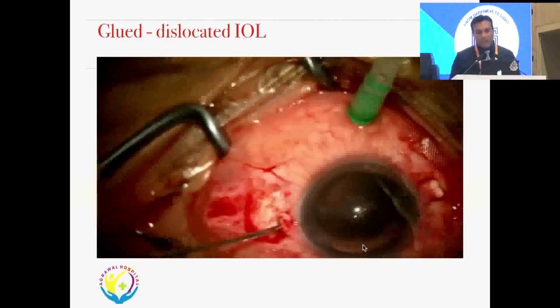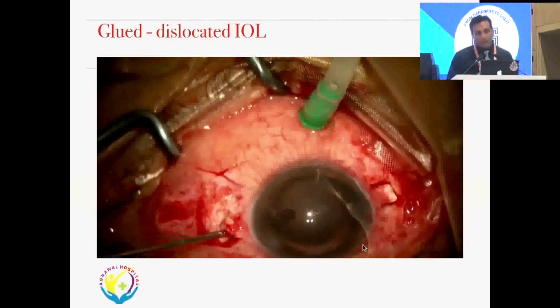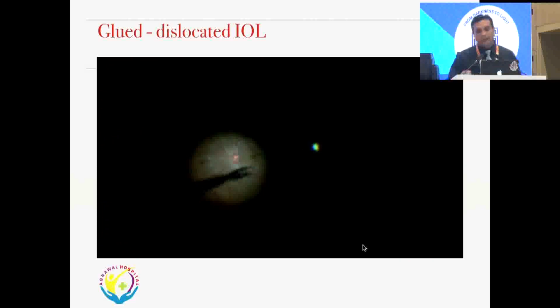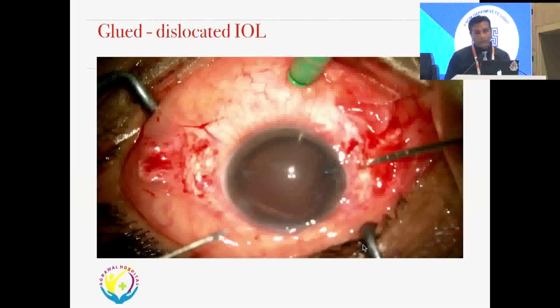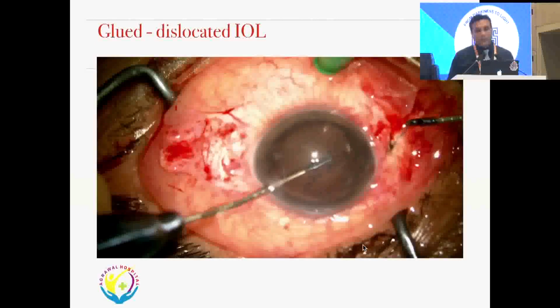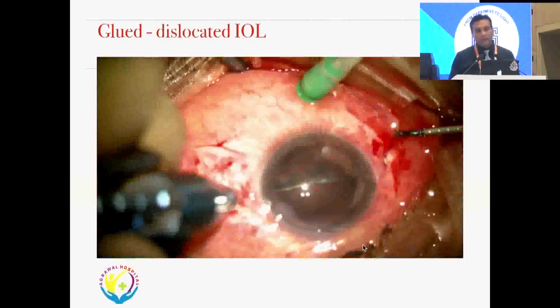See the scleral flaps as compared to the previous case, and these are partial thickness flaps but irregular, ragged. The entry is premature, so I'm dragging the iris root along with it, which can cause a bleed and make the media hazy. So this is again a dislocated IOL, 3-piece IOL, and I'm able to grab it and bring it into the anterior vitreous cavity.